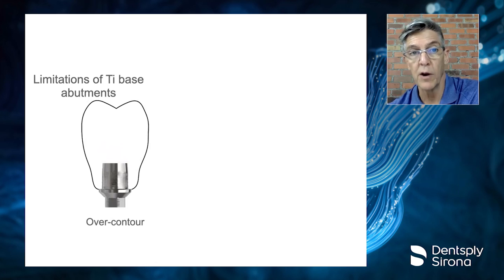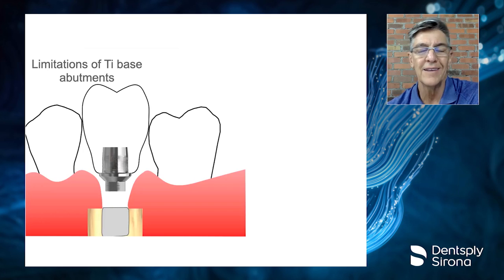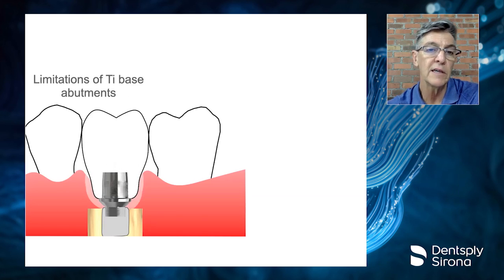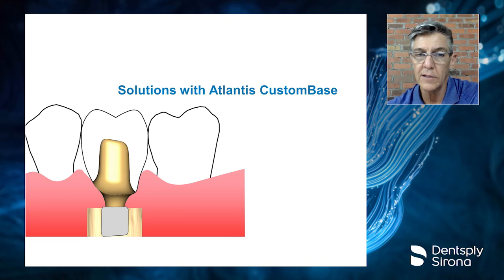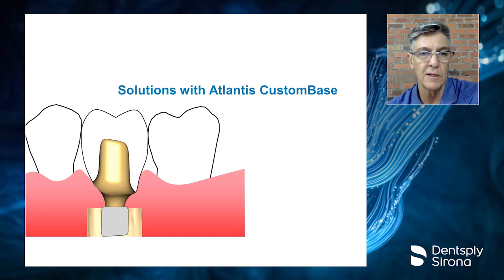Now, to limit breakage problems in a TiBase, you really have to over-contour the ceramic in the deeper areas. And unfortunately, this is a restoration that is a painful experience for our patients because we remove our healing abutment. We don't have a provisional in place because we're using a stock abutment. And when we go to seat, we are distending tissue and creating pressure, and it's very painful for the patient. With a custom base, instead, we are able to develop an emergence profile that is much, much kinder to the tissue. So we can apply pressure if we want to, but we don't have to. We can slide this in and not push the tissue into uncomfortable areas. And so delivery to the patient is quicker, simpler, and less painful.